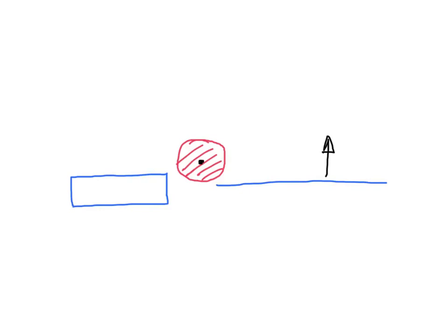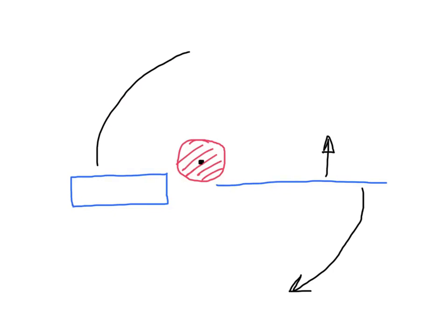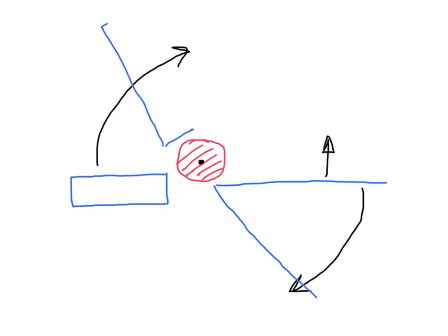Here, the lesion is away from us, or the needle's on the near side. What we're going to do is rotate the hub of the needle towards us and rotate the transducer away from us. You'll see then that our needle is now straight through the center of the lesion, and this works incredibly well.